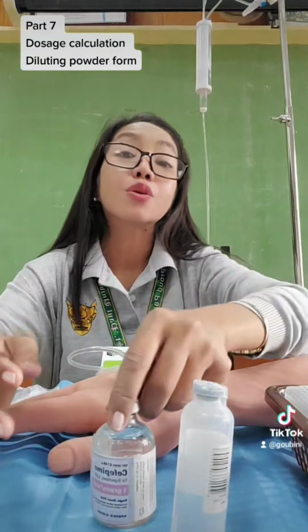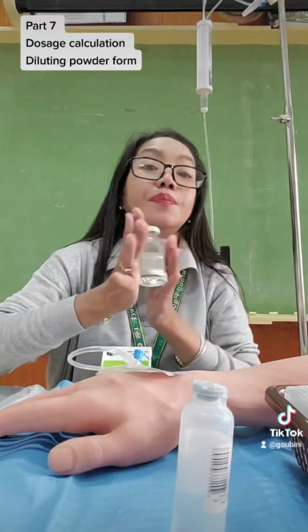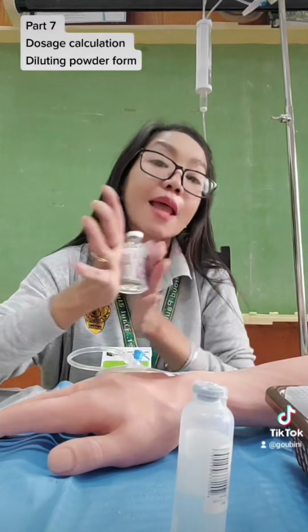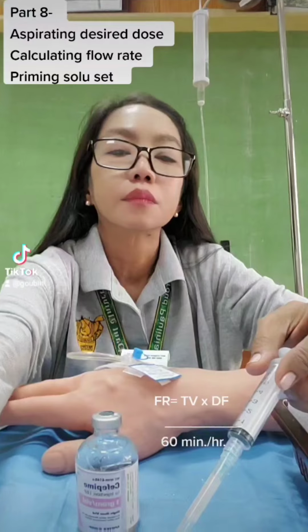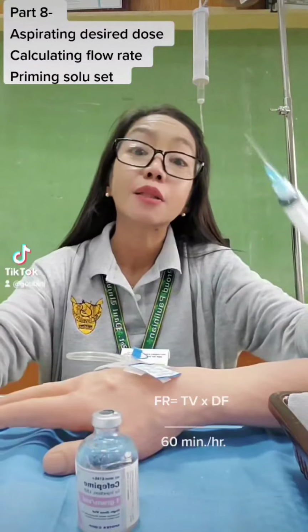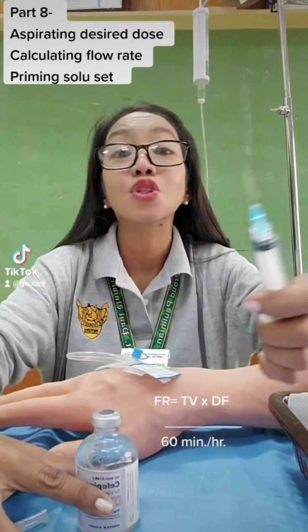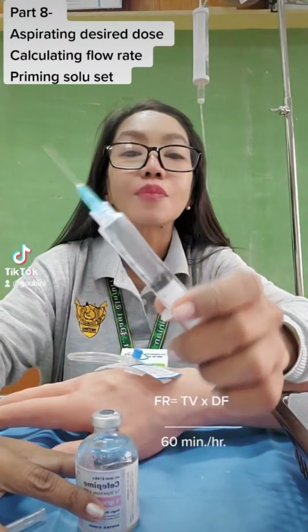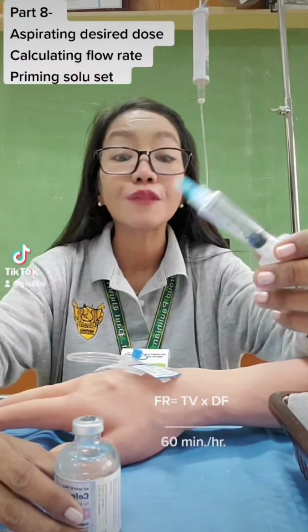Alright, so you will now mix the powdered form in the NSS. Using the same syringe, we will now aspirate your desired dose, which is 5 cc.